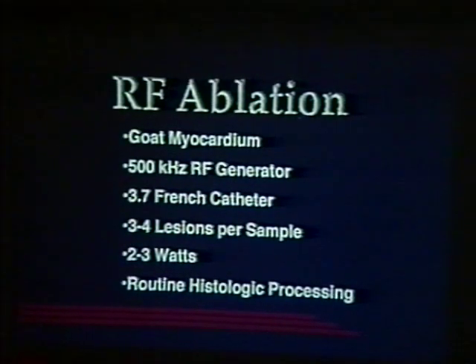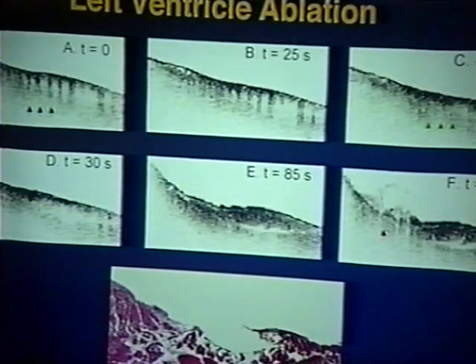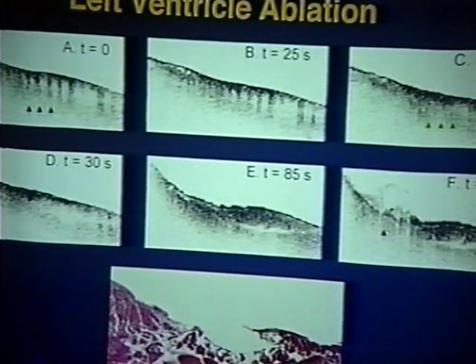Now, I'm going to just briefly discuss some of the interventional aspects. First, comparing OCT with RF ablation. RF, I realize some of you may not have a clinical background, we often put catheters up in the heart to ablate rhythm abnormalities.